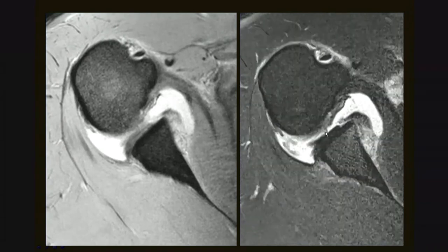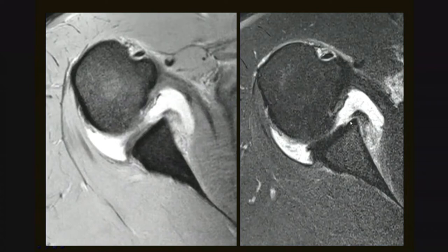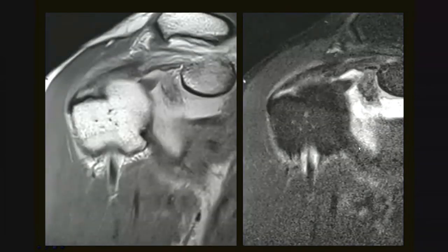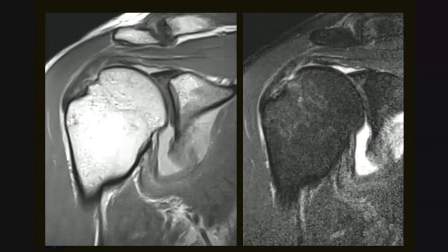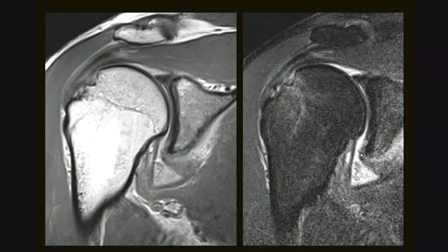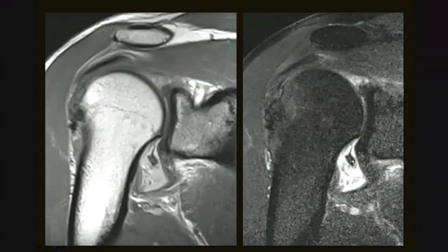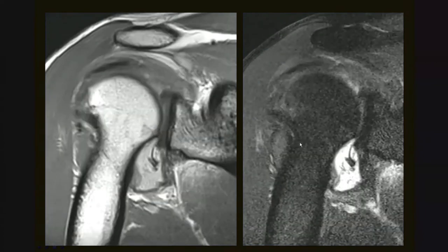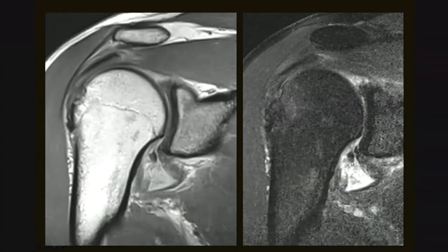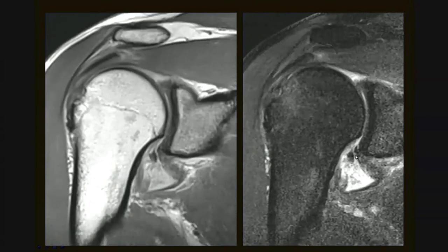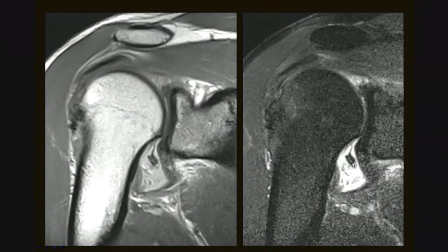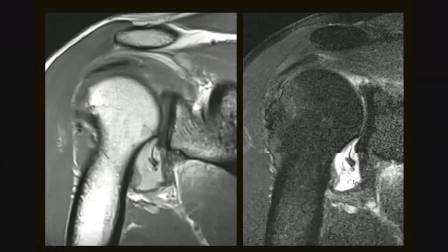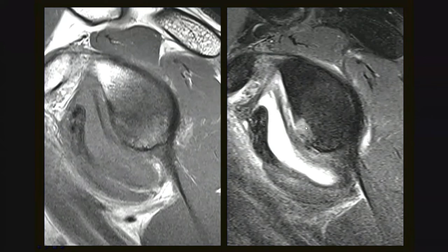On the coronal images of the same pitcher, we're starting to see the glenoid rim. Here is the region where articular cartilage is missing. The cartilage is followed down in the glenoid fossa — here it is gone. This is where the labrum should be located — it's very deficient and small. Here is the displaced labral fragment, and at the end of this small sliver of labrum there's another trilaminar appearance. This area of absent articular cartilage reflects the fact that the cartilage fragment has been displaced into the axillary pouch — labrum and then articular cartilage with its trilaminar appearance.